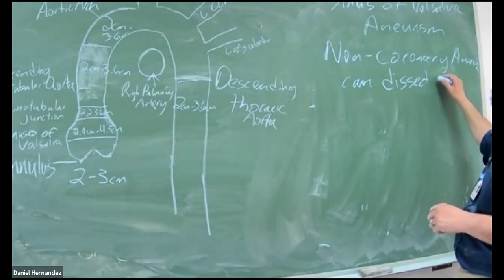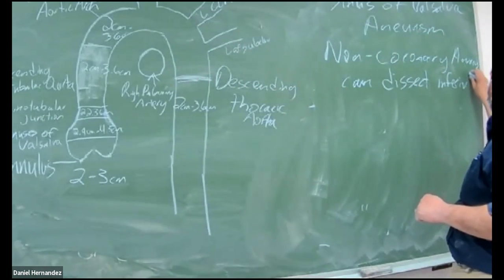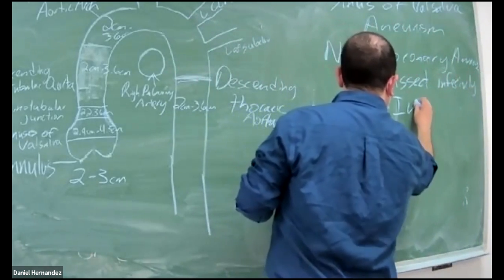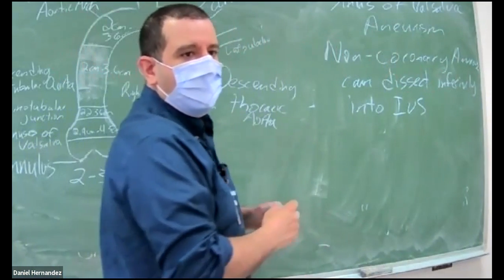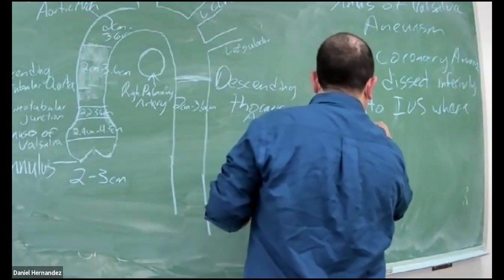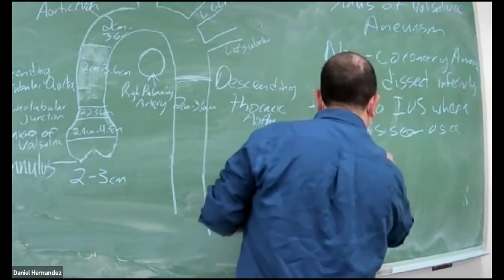That's where it is seen as a cystic structure.